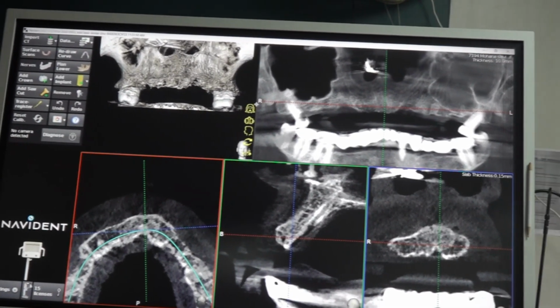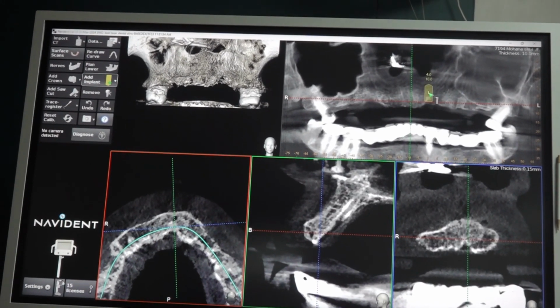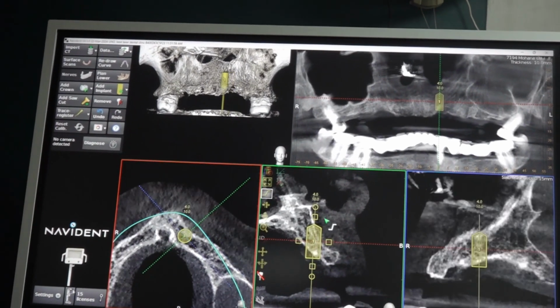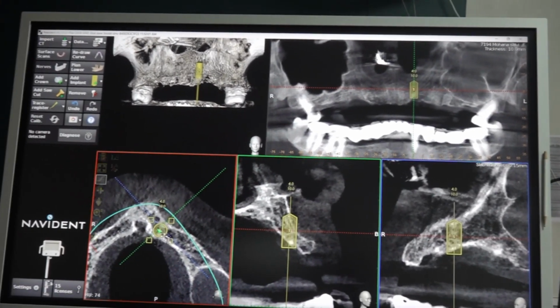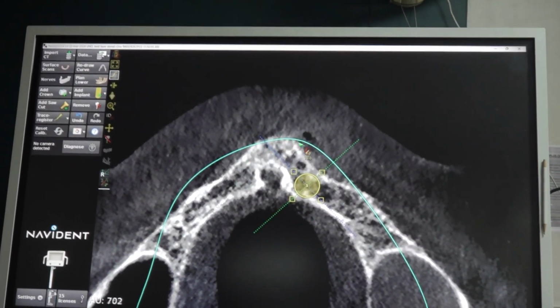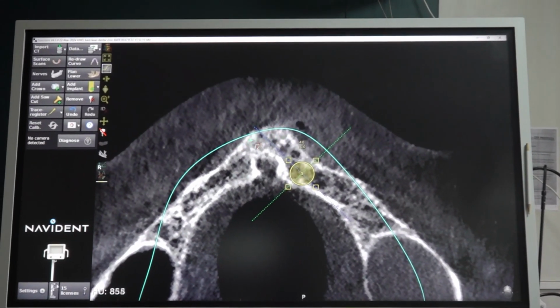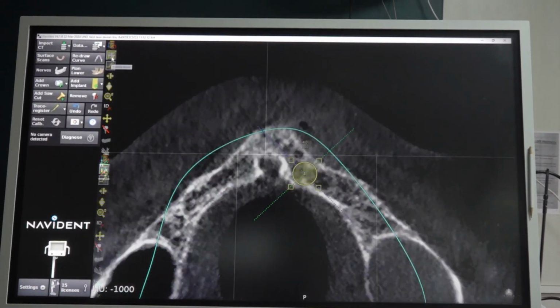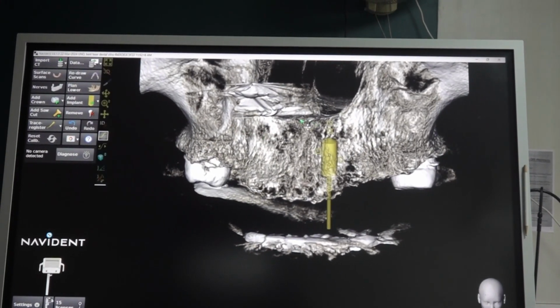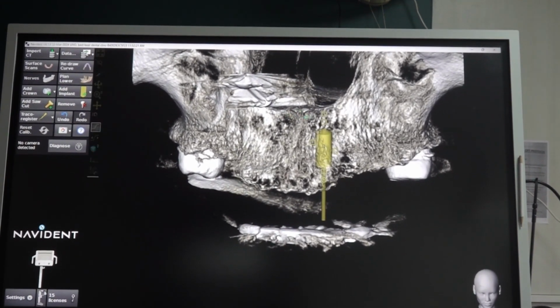We will see the upper one. So when we are planning the upper, we have to keep in mind that we are doing alveoloplasty. Yes, alveoloplasty. So this kind of vertical maxilla, as you can see, this anterior maxilla is too prominent. So we will be doing alveoloplasty here also, this shaving. Okay. So we will be shaving maybe till the nasal spine. That is why some patients tell they have discomfort in this region, the nose region.